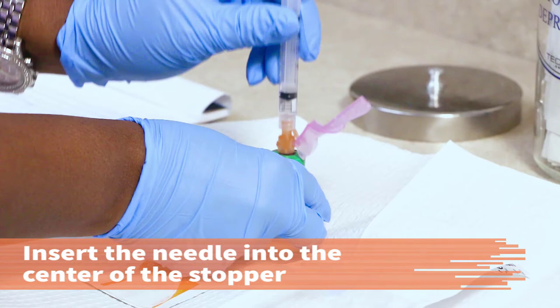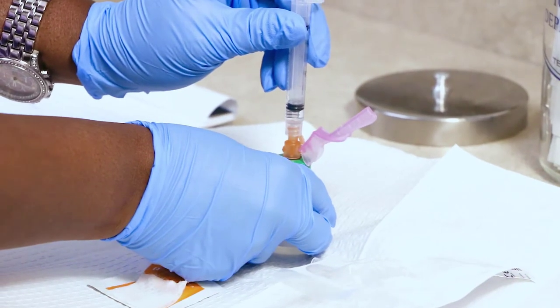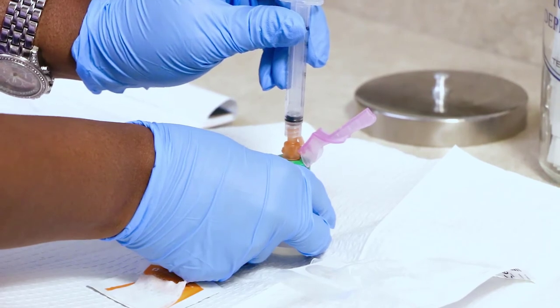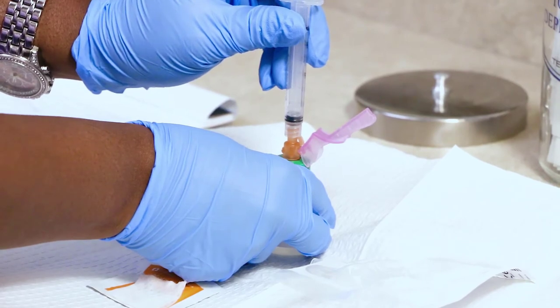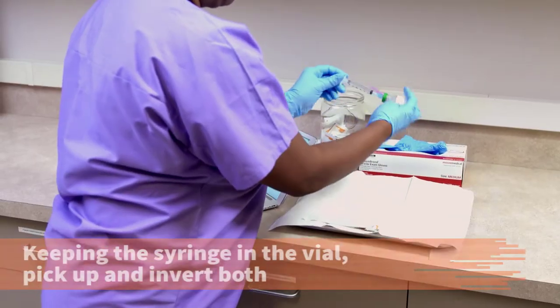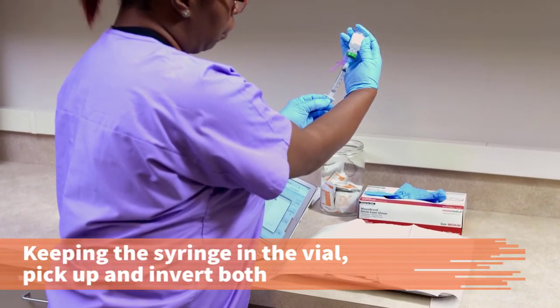Hold the vial firmly against a flat surface and insert the needle into the center of the rubber stopper, ensuring the needle touches only the cleaned rubber area. Inject the aspirated air into the vial, making sure the needle is not in the liquid. Keeping the needle in the vial, pick up and invert them.